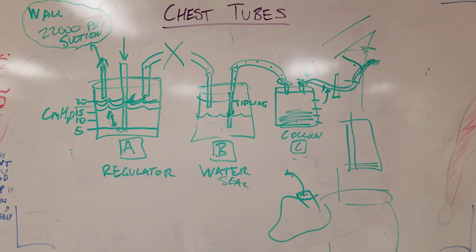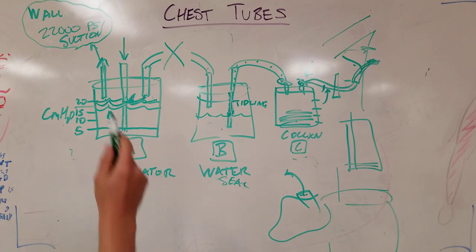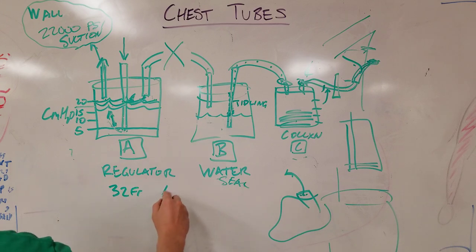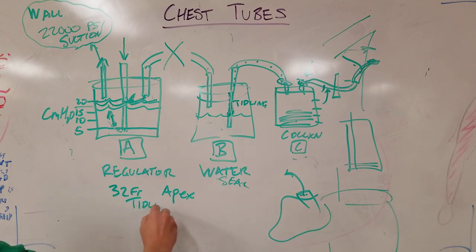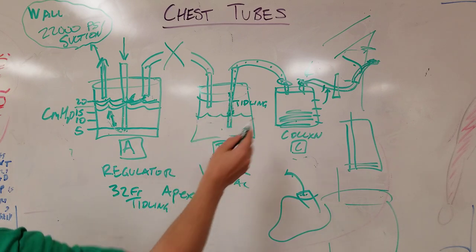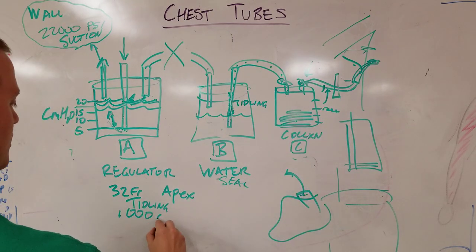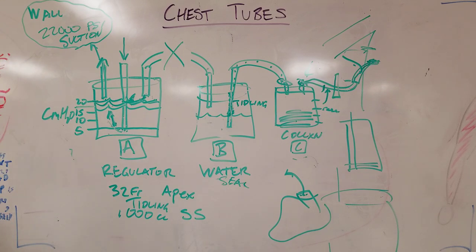So the way to report a chest tube when you're on rounds is, hey, this guy has a 32 French straight chest tube that's in his apex. It is tidaling. It has put out 1,000 cc's of serosanguineous fluid since placement, or 20 cc's over the last shift, or 30 cc's of frank blood since placement, or whatever you want to say. And it is currently to suction. And then lastly, you want to say whatever your plan is.